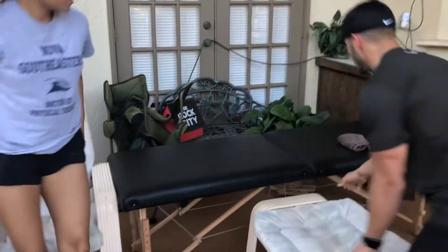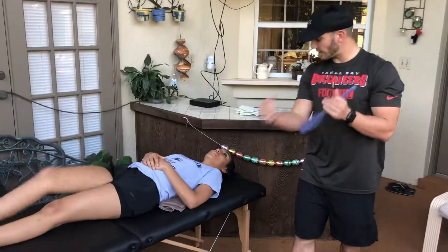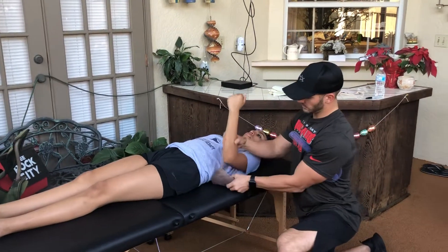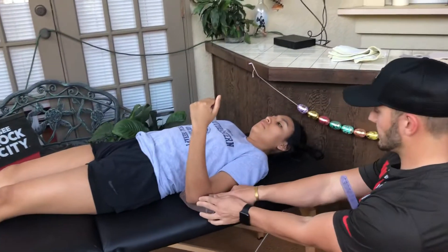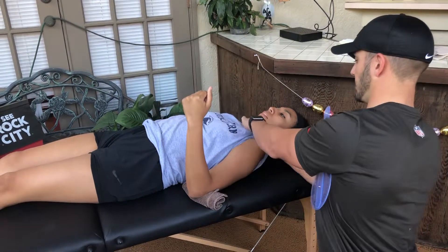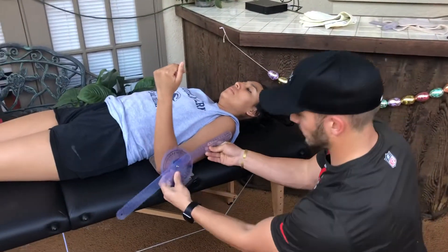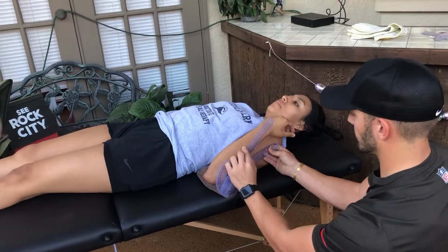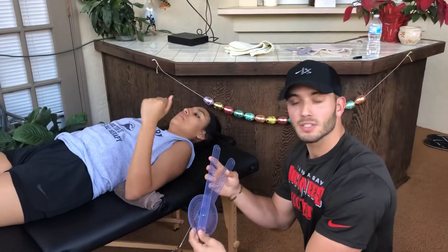Now I'll have you lie on your back for me, please. I'm going to do elbow flexion and extension now. I will put a towel underneath the elbow. My axis of rotation is going to be the lateral epicondyle. My stationary arm is going to point up to the acromion, and my moving arm is going to go to the radial styloid. Go ahead. I have 158 degrees. AOS norm for this is 150.